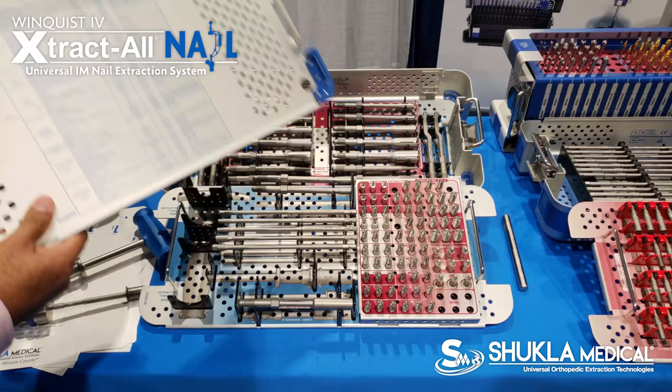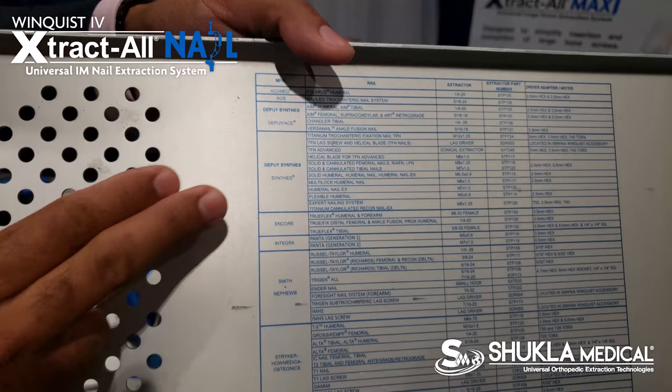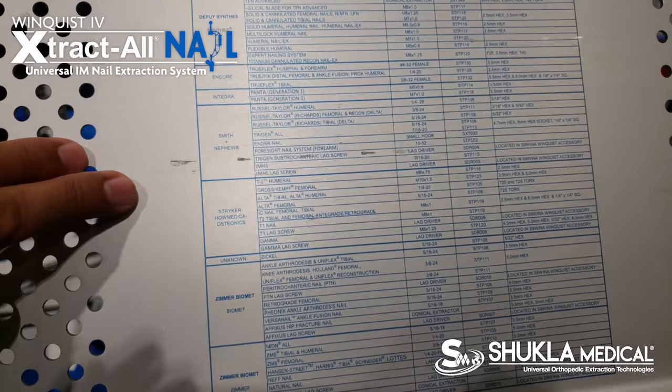What we have in the back of the lid of this tray is multiple different company names and their products, such as DePuy Synthes, Encore, Integra, and Smith & Nephew — these are the nails that you can then match the thread to.